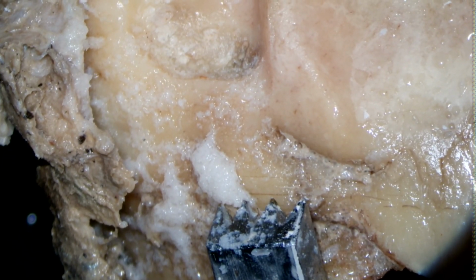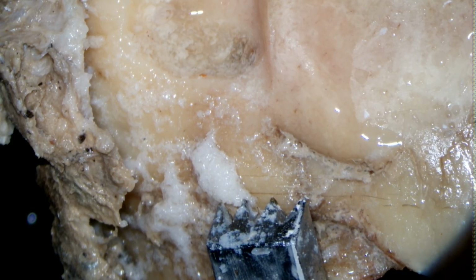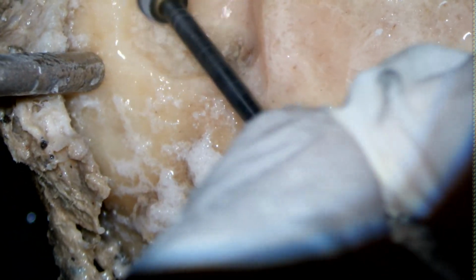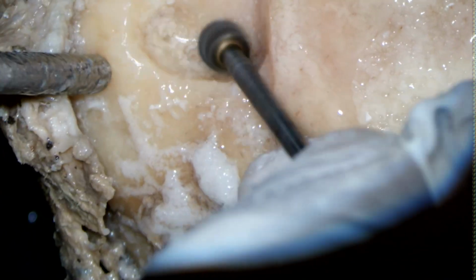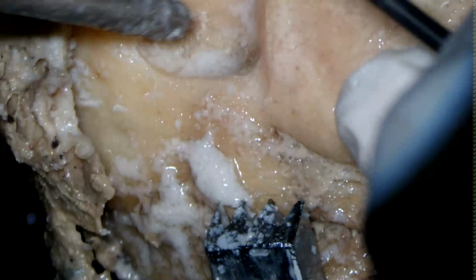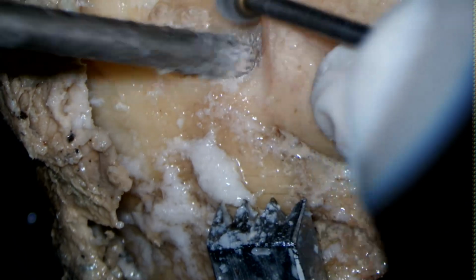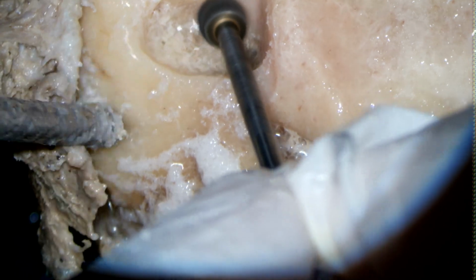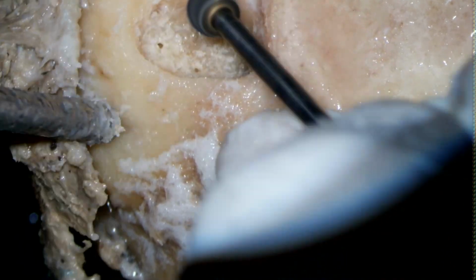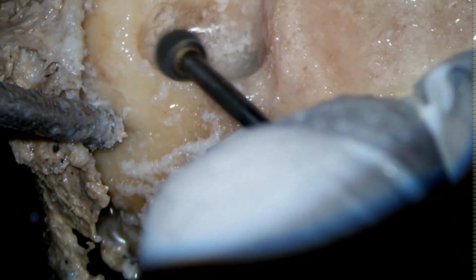So if you have any questions, you can ask. So I was talking about contracted antrum. So how to tackle a contracted antrum. So for contracted antrum, it is important that you should first delineate the sinus plate and the dural plate.